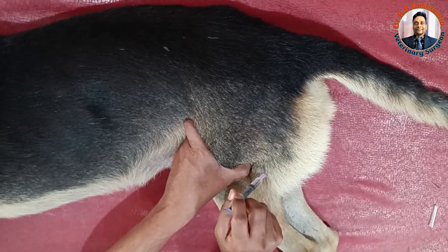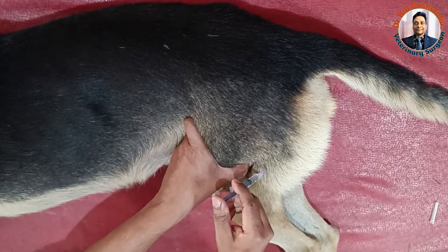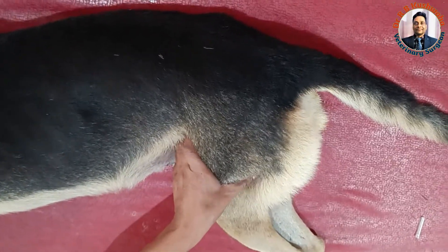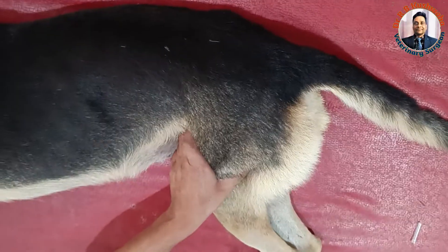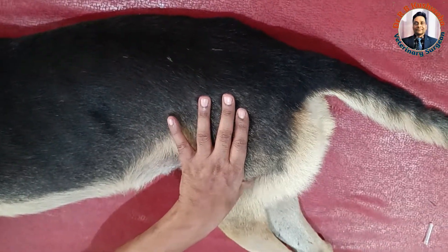You can withdraw the plunger to check placement, then simply inject. This is how we give the intramuscular injection in the semimembranosus or semitendinosus muscle.